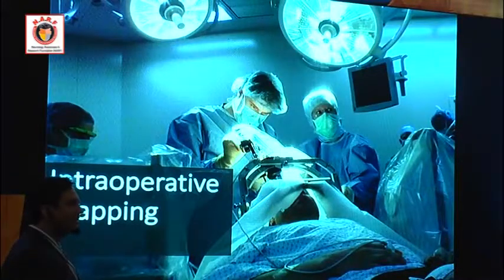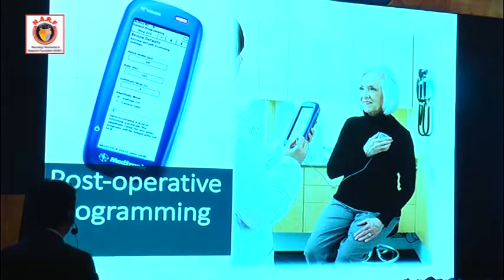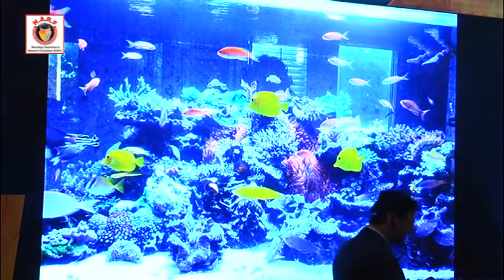Intraoperatively, you have to do mapping on these patients. After selection, you do post-operative programming on these patients with all the protocols, and we are getting close to the last portion here and solving the question for Raza.